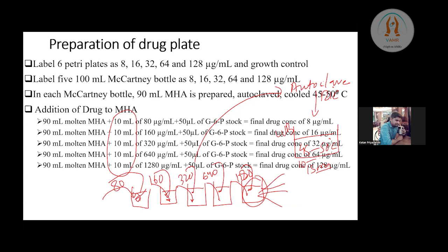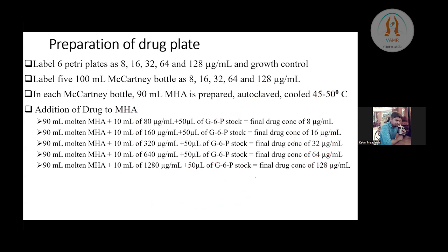That's for a technician, and it's not very tricky to understand. Preparing the drug concentrations is the tier one task. Preparing the plates is very easy. You just have to stick this page in your media room and give basic instructions to your technicians.